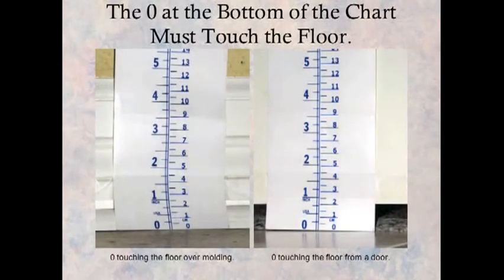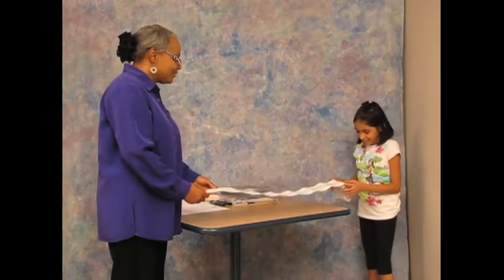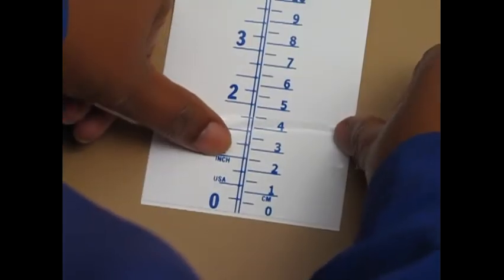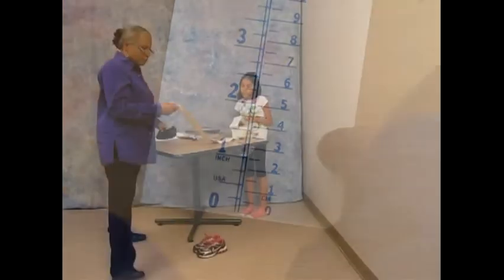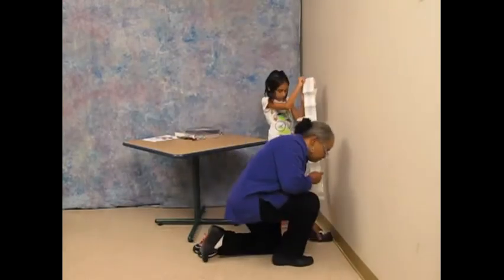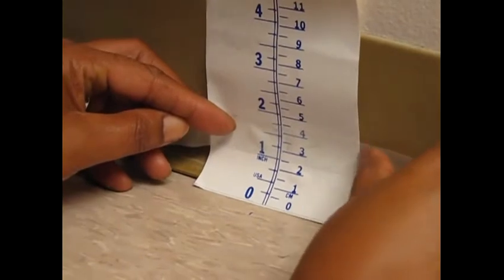the height chart. Before you begin, it is important to understand that regardless of whether the wall or door is flat or has molding, the zero at the bottom of the height chart must touch the floor. Now, start by unrolling the height chart to at least the 60-inch line. Next, put a piece of tape across the chart at the 1-inch line. Now tape the height chart to a wall or door so that the zero at the bottom touches the floor.